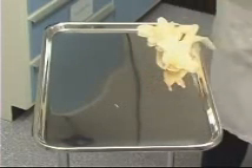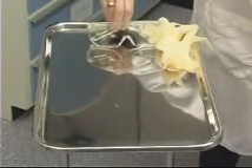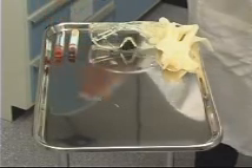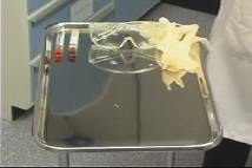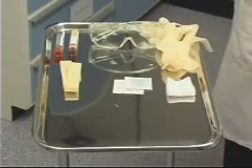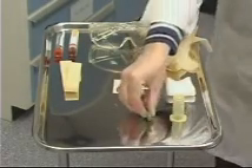Today we'll demonstrate the technique of phlebotomy. The equipment necessary for phlebotomy is as follows: protective gloves, protective eyewear, the necessary blood collection tubes, tourniquet, povidone iodine solution and an alcohol swab for cleaning the skin, a piece of gauze to cover the site after, vacutainer holder, vacutainer needle, and a piece of tape to secure the gauze.